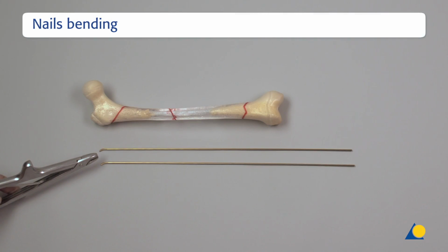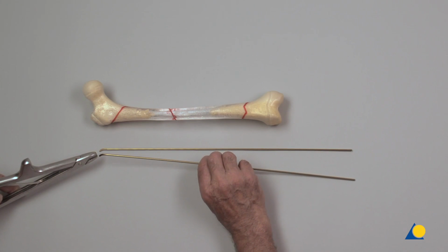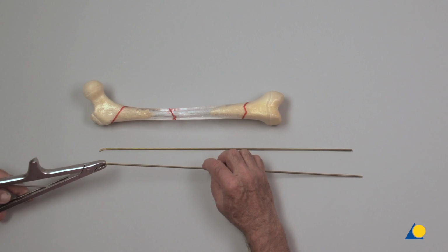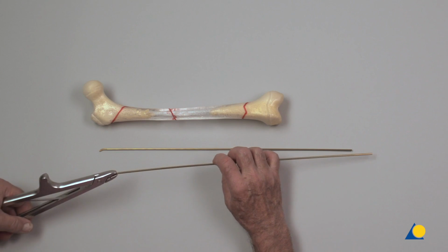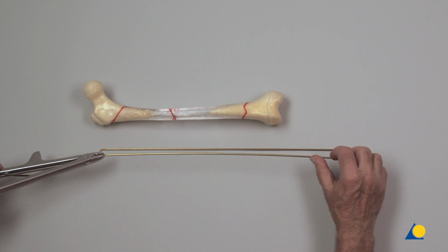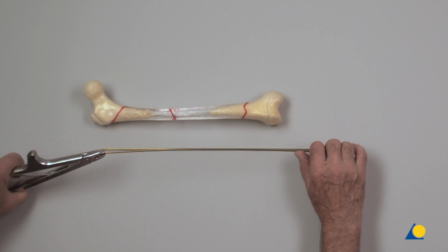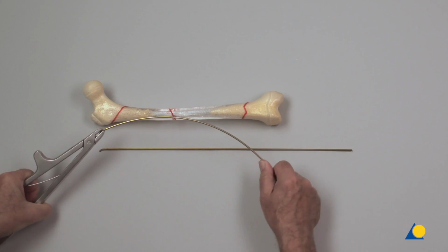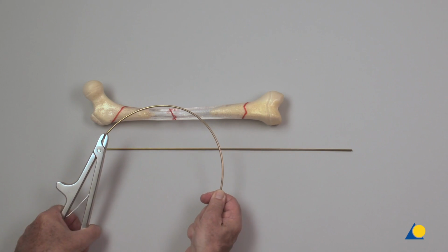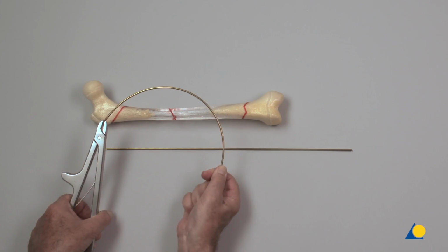The tip of the nail is fixed in the pliers and the nail is contoured by hand. It is important to pre-contour the nail in the plane of the tip. In terms of the biomechanical nail properties, good contact of the nail with the inner side of the cortex is essential, particularly for long oblique, spiral, or complex fractures where a danger of shortening exists. Pre-bending the nails in these cases is highly recommended.